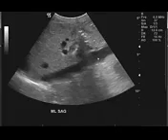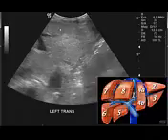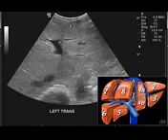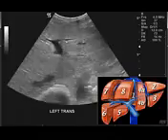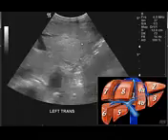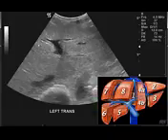Now, to discriminate the inferior vena cava from the abdominal aorta, there are two things that I will stress as we go on. Here's a transverse view of the liver, but just showing a little bit of the lateral segments of the left lobe that we know now are called segment 2 and 3. 2 is high by the diaphragm and 3 is lower. And when you see the left portal vein, which is seen here, this is already segment 3. This is segment 3, and we have some areas that are more echogenic compared to other areas. So this is the left portal vein, lateral branch, medial branches of the left portal vein.